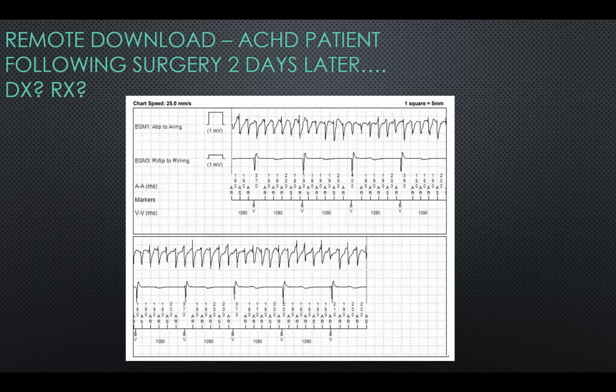I tried about 18 or 20 times and paced as fast as 350 to 380 beats per minute, even. And again, the only reason I felt it was safe was because she has complete heart block. So I knew that the ventricular rate throughout all of this was going to still be about 60. Unfortunately, we were unable to pace terminate this.